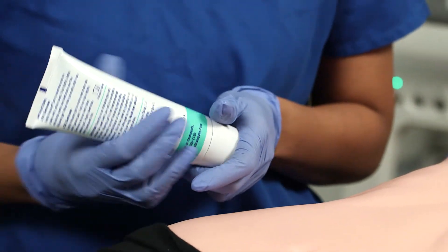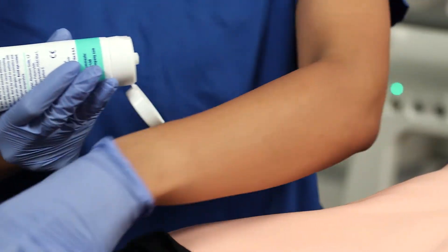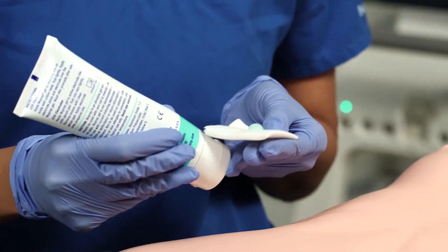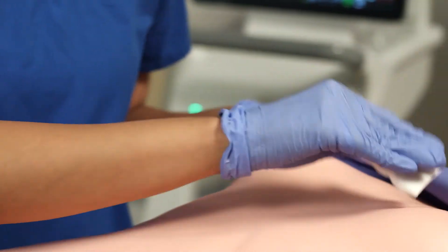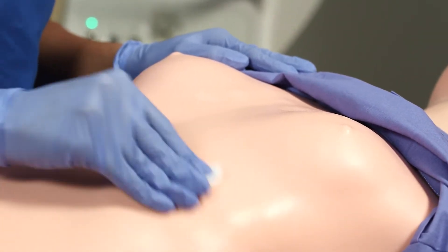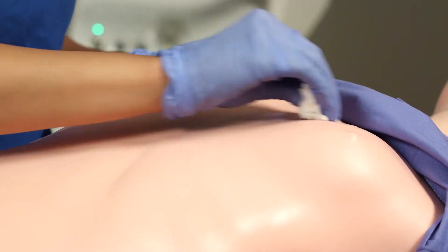After the patient is shaved, use the skin prep gel on the areas where the quatrodes will be placed and briskly rub the selected sites with the gauze pad. The skin may turn pink. This gel is an exfoliator and gets rid of dead skin cells. Wipe off any excess after scrubbing.